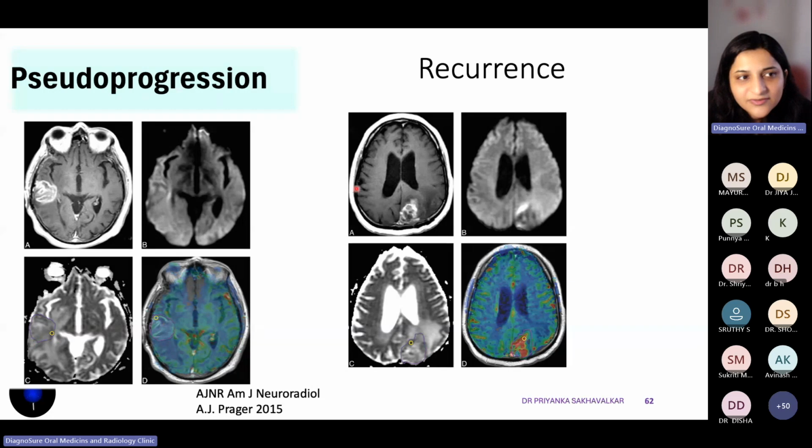So this is very crucial when we are assessing the tumor treatment response, especially in brain cancers, and these are also relevant in head and neck cancers, but not that commonly used for orofacial cancers. These different scans help us determine the treatment response.